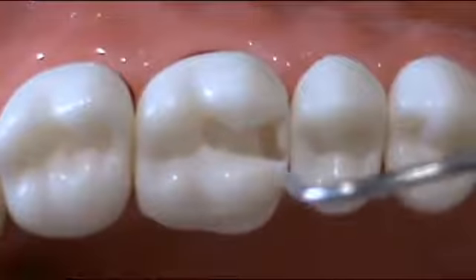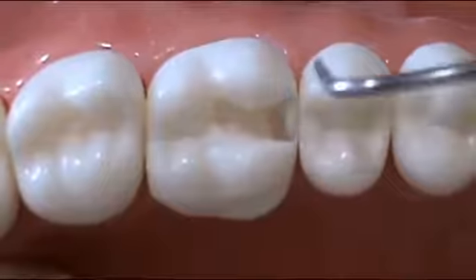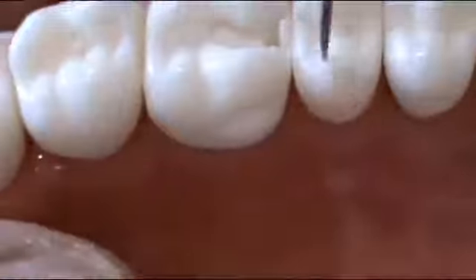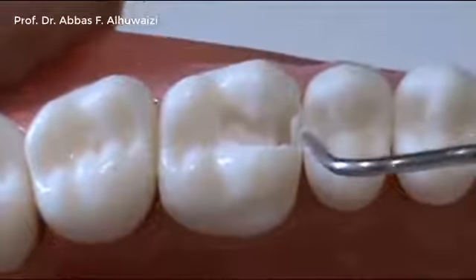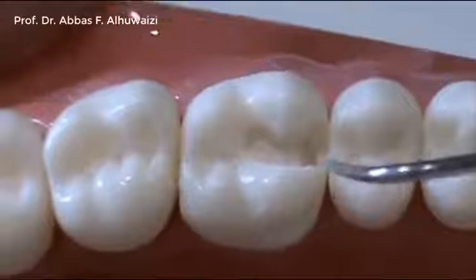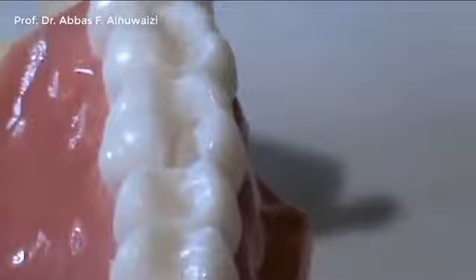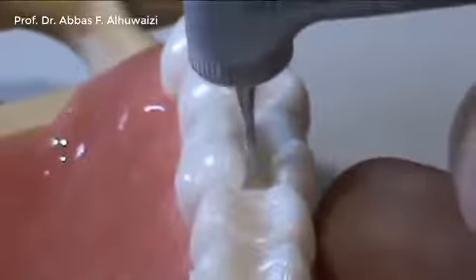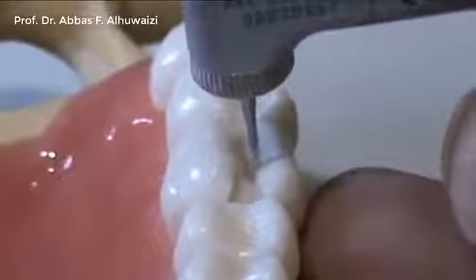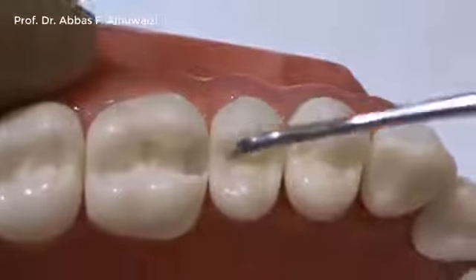Now break this part by placing a sharp instrument between the shield and the adjacent tooth structure and pushing distally. The walls of the Class 2 box should also be converged occlusally and diverged proximally.